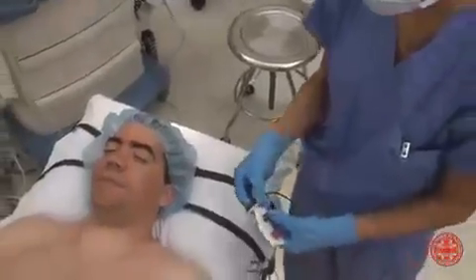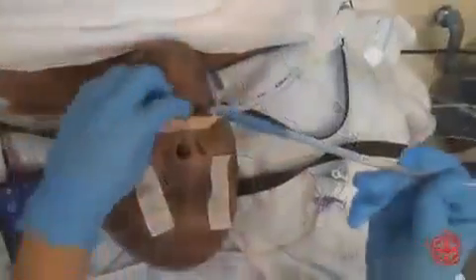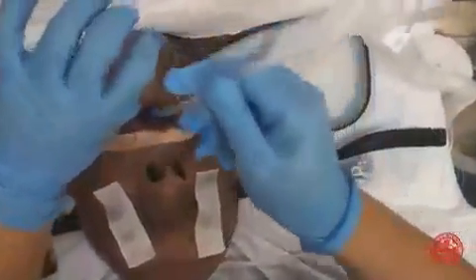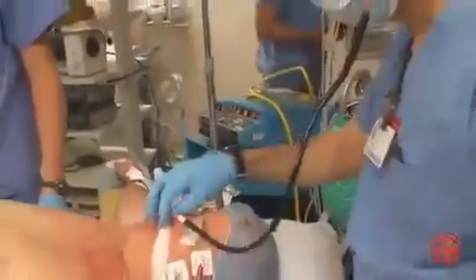The color-coded electrocardiogram leads must be positioned correctly, according to standard guidelines, to obtain an accurate reading. Occasionally, these leads are placed in unconventional locations due to the nature of the surgery or the positioning of the patient. Anesthesiologists also frequently use an esophageal stethoscope equipped with a temperature sensor, which is inserted after the induction of anesthesia. This device can be used both to auscultate breath and heart sounds and to measure the patient's temperature.